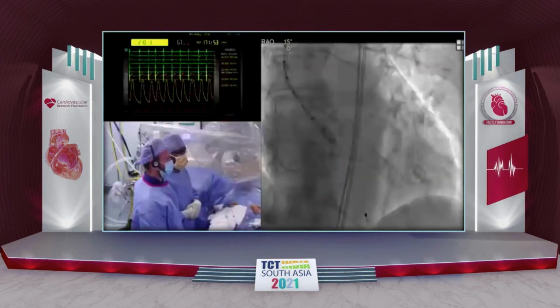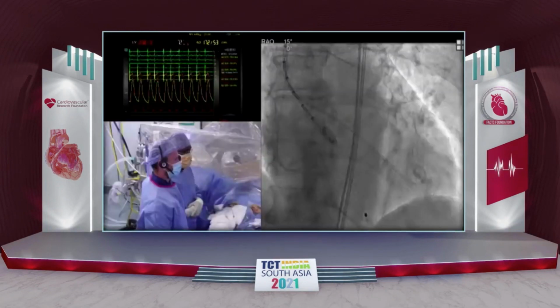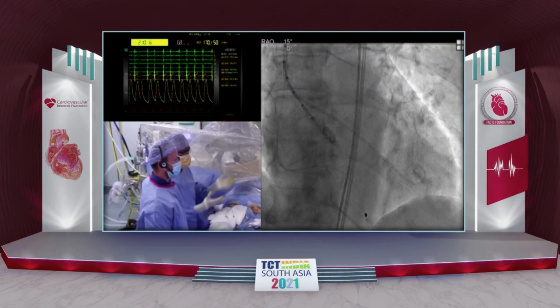Yeah, that's a really important and intriguing question. I think that's something that all of us are going through at the moment, right? What to do next. And my thought is, I think it's heavily calcified, not to use a balloon expandable. So there's a heavily calcified anatomy, so I would prefer not to use a balloon expandable.